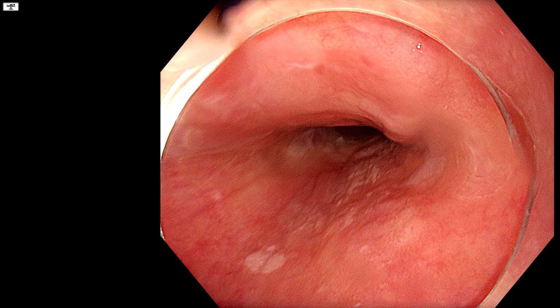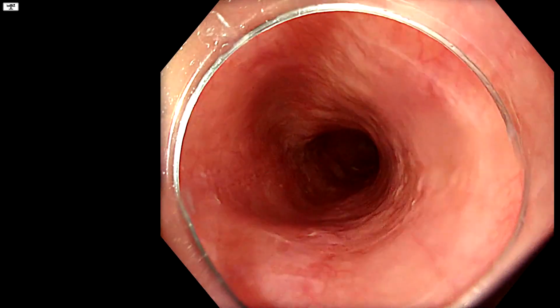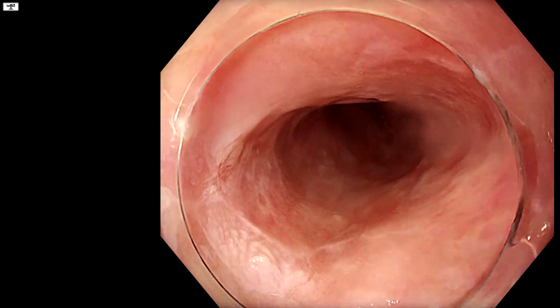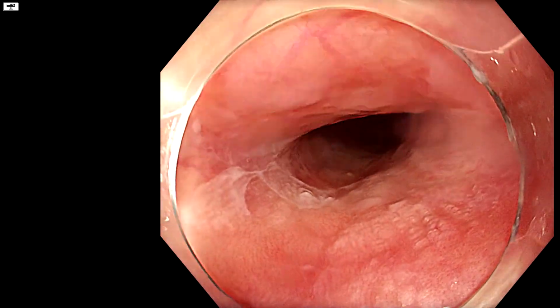So maybe this is something that you don't see very often. There's an esophagus very chronically inflamed, as you can see if we start at the top. Now we go down and there's a little relative stenosis here. This is a site of previous radiotherapy for a squamous cell carcinoma of the esophagus. We're at 33 centimeters.